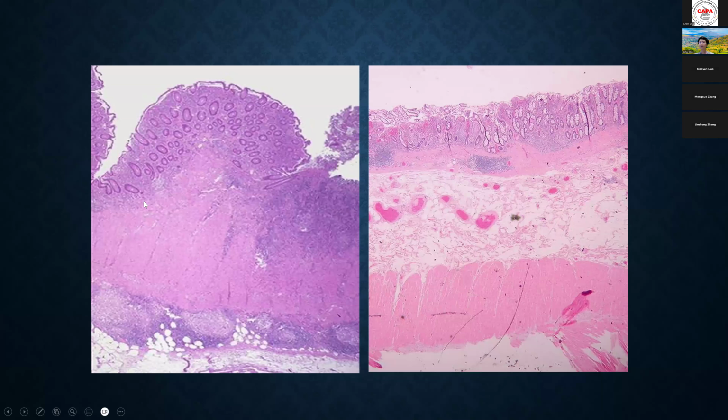You can see this picture, and on the left side is obvious Crohn's disease, right? You see transmural inflammation, you see granulomas, lymphoid aggregates just next to the muscularis propria. And then on the right side it clearly looks like UC, and you can see the superficial inflammation, but down deep it's all clean, right? That's the resection specimen. So if we take a superficial biopsy, can we really tell the difference between Crohn's and UC? And do we need to?